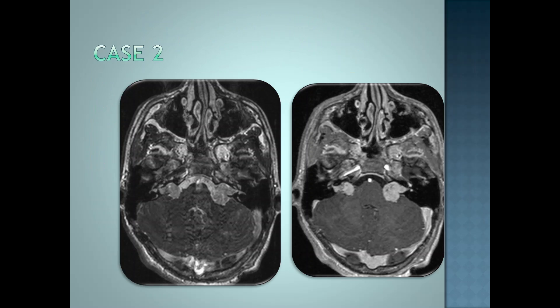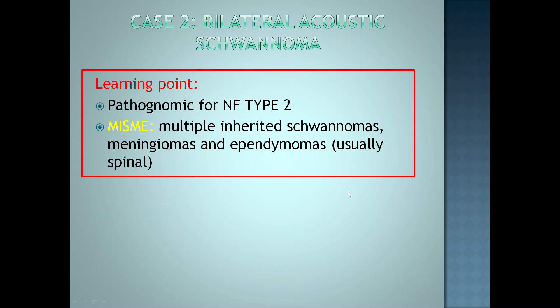Second case: these are bilateral ice cream-shaped lesions in the cistern extending into the internal auditory canal with enhancement. So these are bilateral vestibular schwannomas, diagnostic for NF type 2. NF type 2 has multiple inherited schwannomas, meningiomas, and spinal ependymomas.